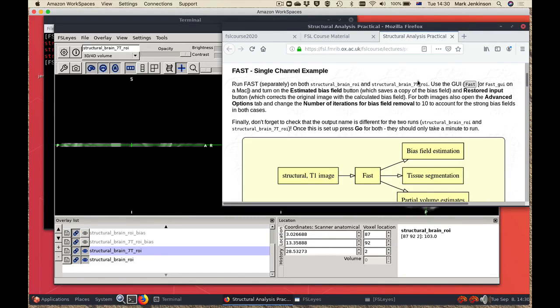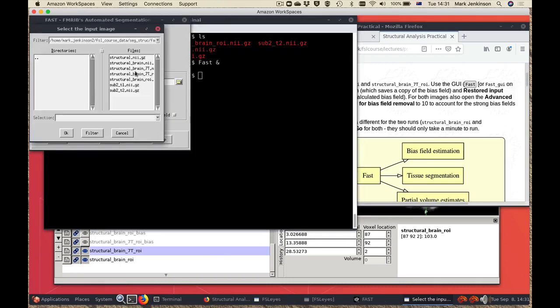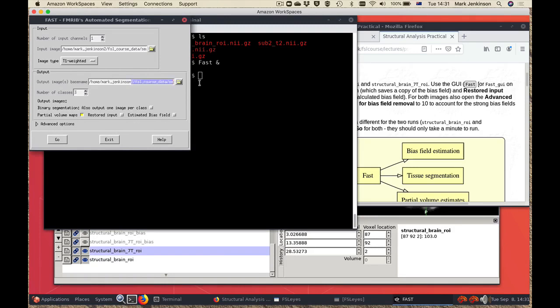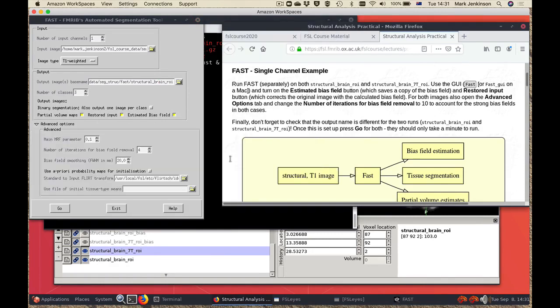We're going to run FAST to estimate the bias field and create a segmentation. We start the GUI, input the image, and it automatically fills in the output base name — it won't overwrite the original but will create other images with different extensions. I want to save both the restored image and the estimated bias field, and I'll increase the number of iterations for bias field removal to 10, to reflect that these images have a relatively strong bias field. I'll then click go and run it for both the 3T and the 7T image.